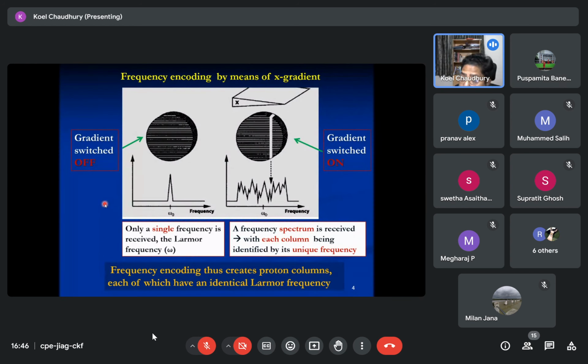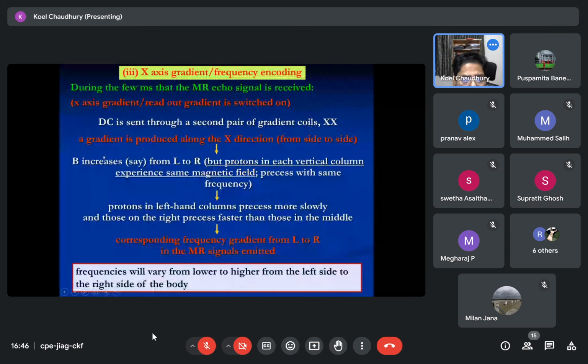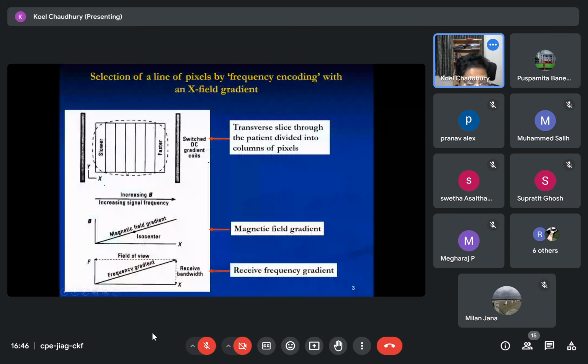We are increasing the, not the frequency, wrong terminology. We are increasing phase, the phase of the frequency. No, you can't play around with phase and frequency. You are increasing what? Gradient. Gradient. Very good. Which gradient? The gradient of the frequency, the field gradient, right?